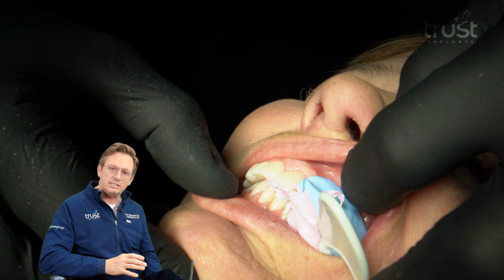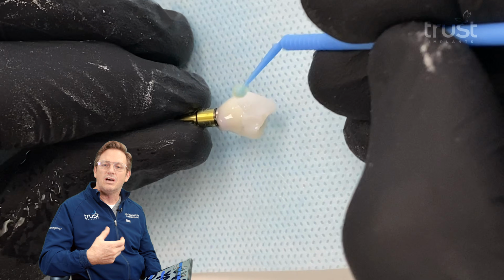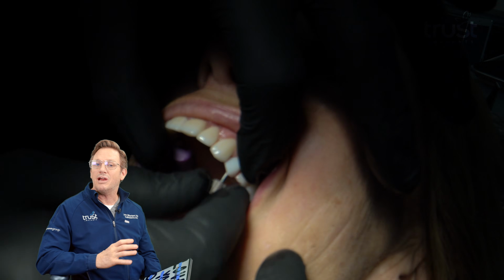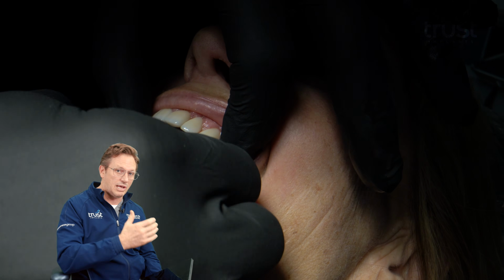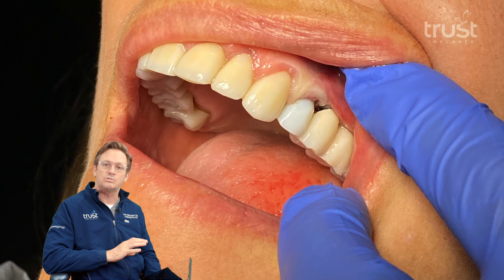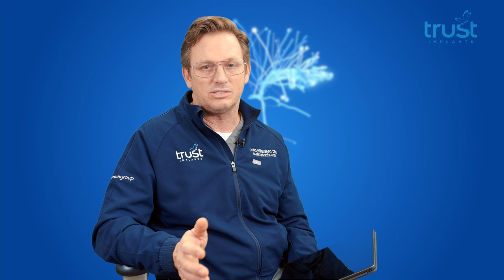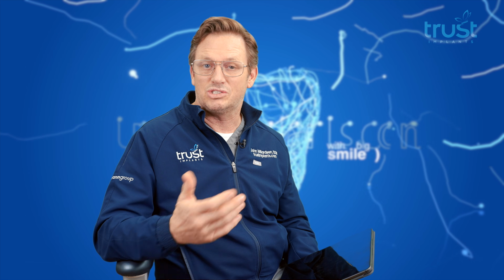Once the implant is in place, I start the process of fabricating and creating the emergence profile of the provisional prosthesis, so that when I place it into the mouth, I'm able to create that architecture and maintain everything that the patient has lost. She's lost the coronal aspect of the tooth, she's lost the root, and ultimately has lost the entire tooth. So it's important for us to preserve and maintain the architecture and the emergence profile of that tooth, even though we're working with artificial materials. Implants are not teeth, but we do everything in our power to make the implant look just like the tooth.